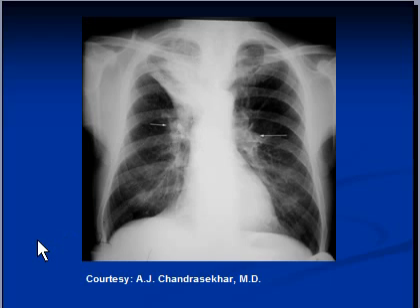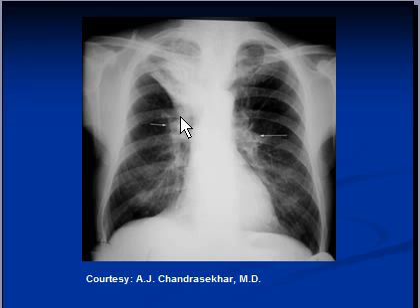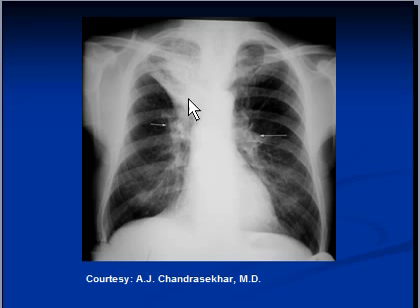The features that differentiate a lobe collapse from consolidation are: absence of air bronchogram, which is evident in this case, and displacement of the fissure. The horizontal fissure, or minor fissure, has been displaced upward. The medial portion of the horizontal fissure holds its association with the hilum, and the lateral edge moves up, creating a V shape.